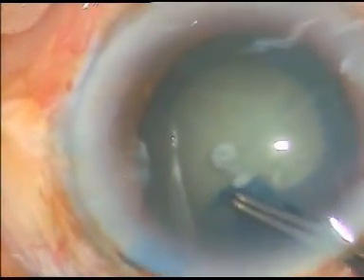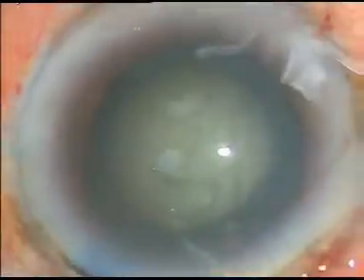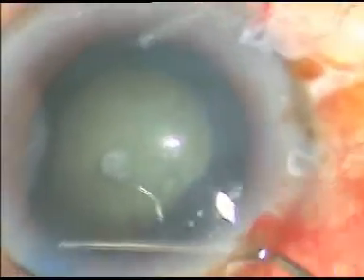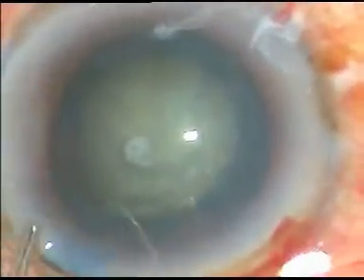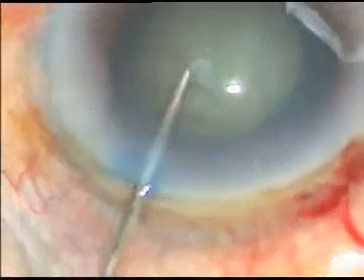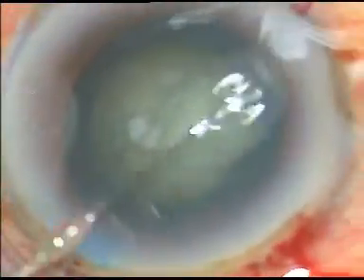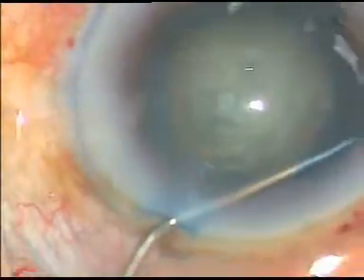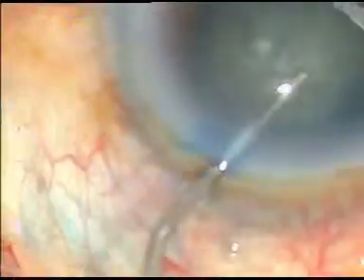Once the capsulorrhexis is done, the capsule is separated from the lens matter by hydrodissection. In this particular case, hydrodissection is being done at two points. After the second point, the nucleus is fairly mobile.